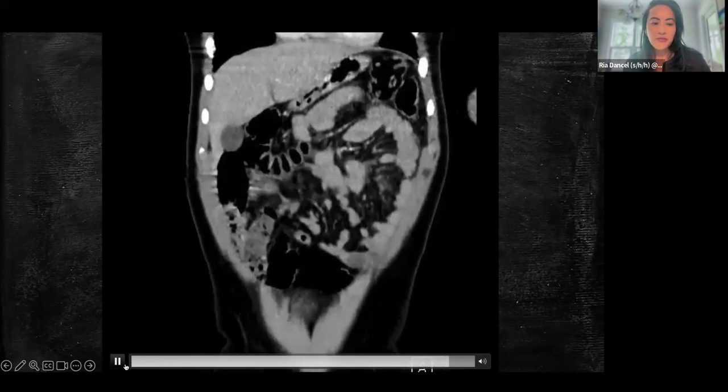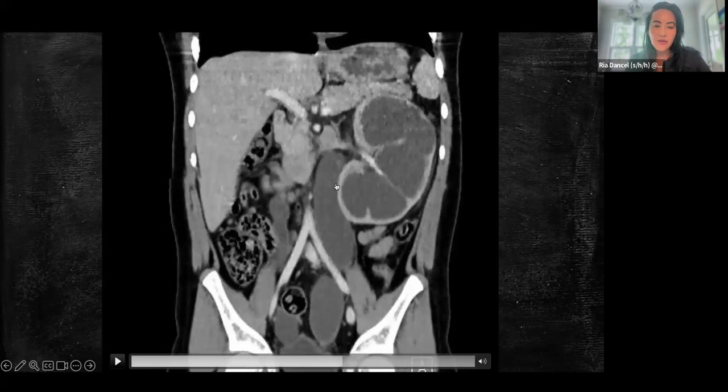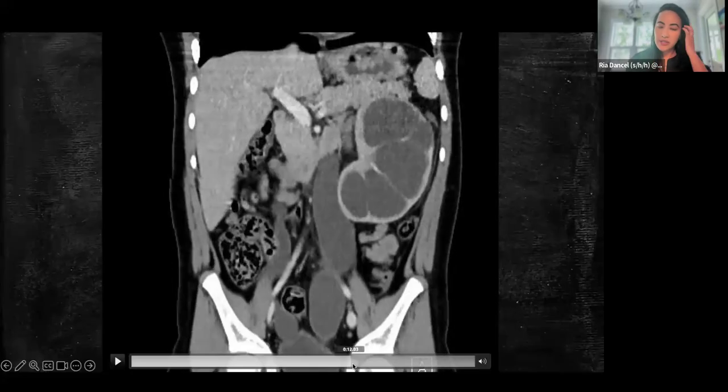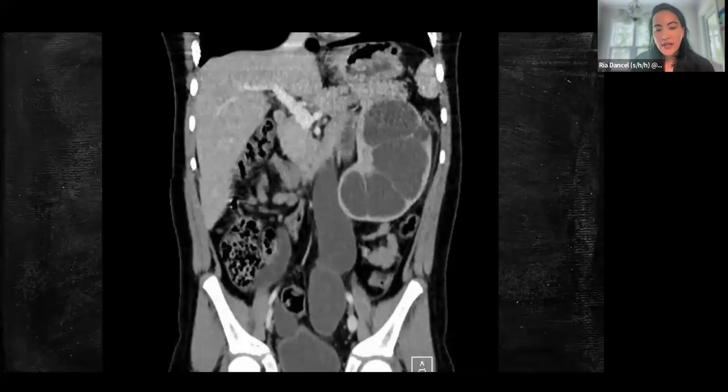Like I said, this is the second time that I've seen this, but what's going on is that the ureters during development didn't insert into the bladder at an angle that would allow drainage of the kidneys. This 10-year-old has been living with this all of his life. The stone was what brought him to attention, but the stone was an effect, not a cause, of the hydronephrosis, because there's so much urinary stasis.